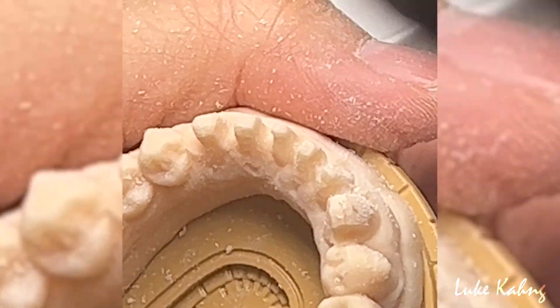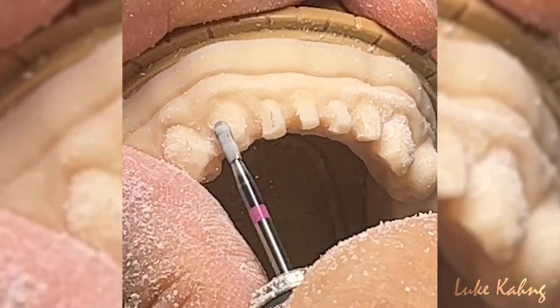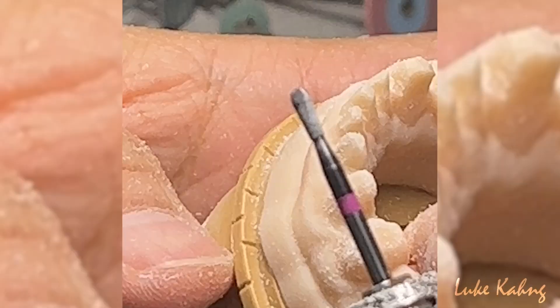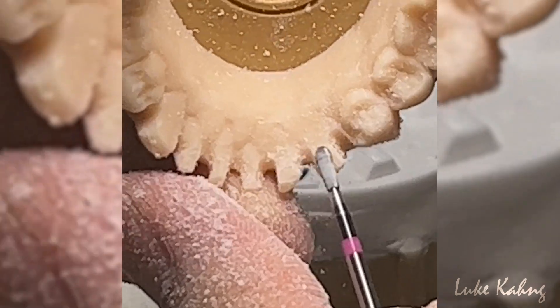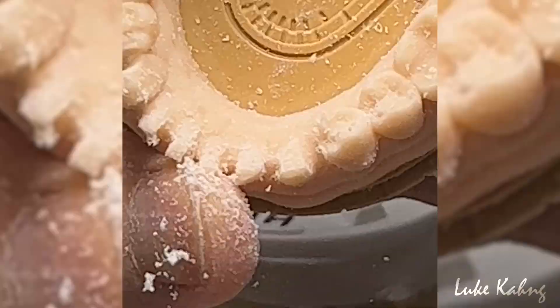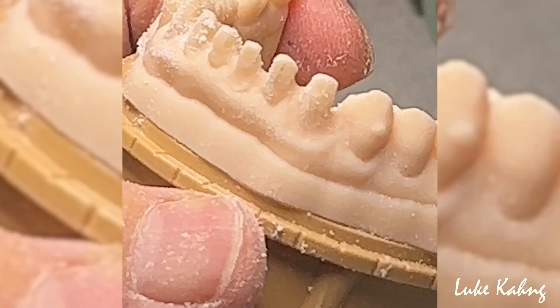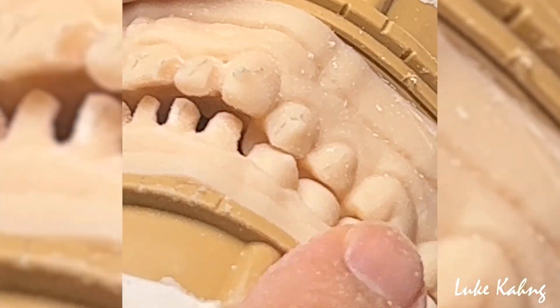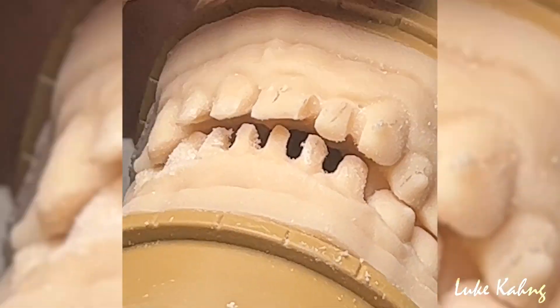It's still too thick, so I'm going to bring it in. Here is too thick — just cut it. Pretty much, it's good. Think about it — here and there — the huge differences. Now check the occlusion contact. I will see — have a good room. Beautiful.